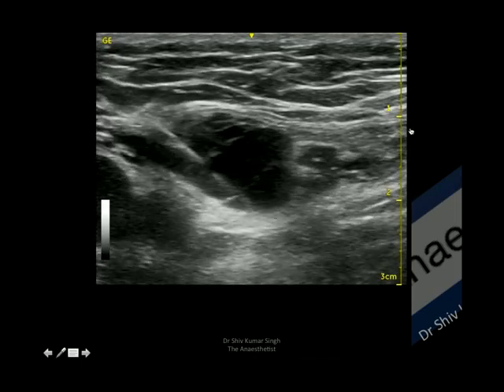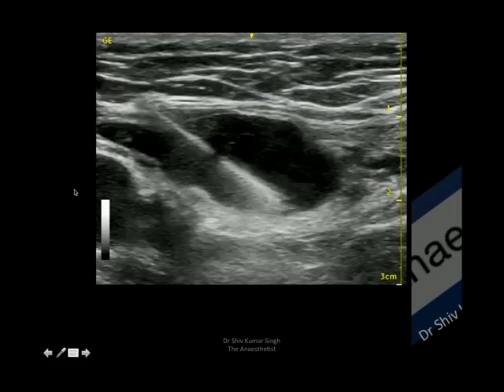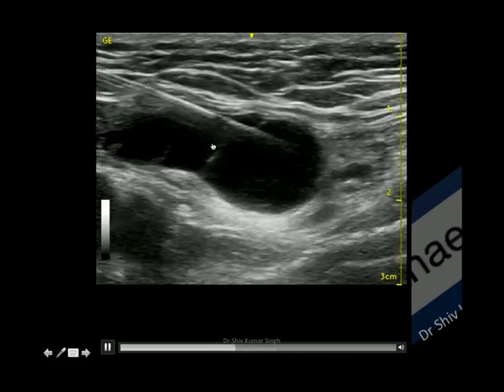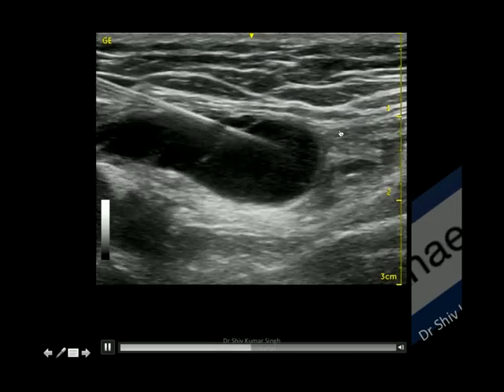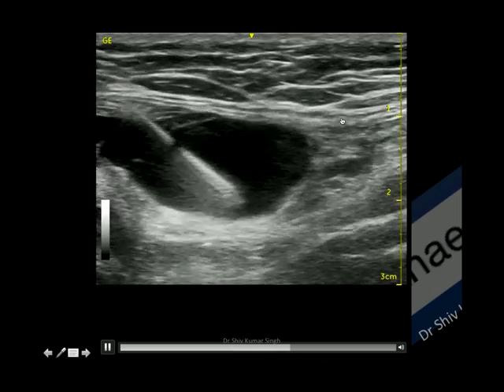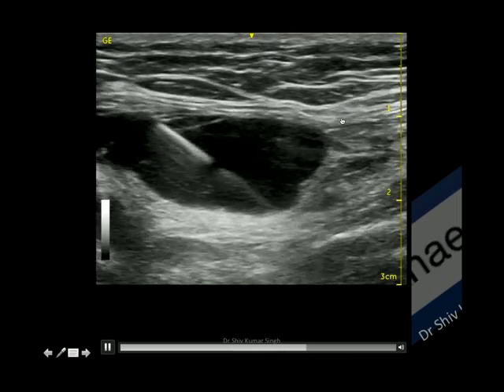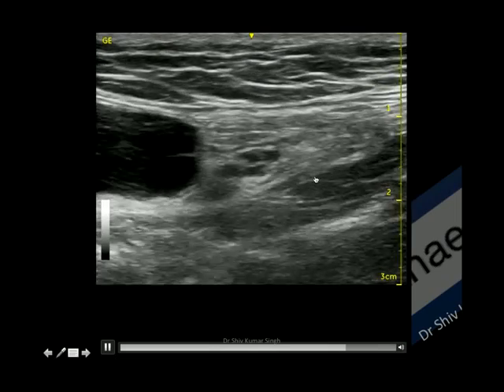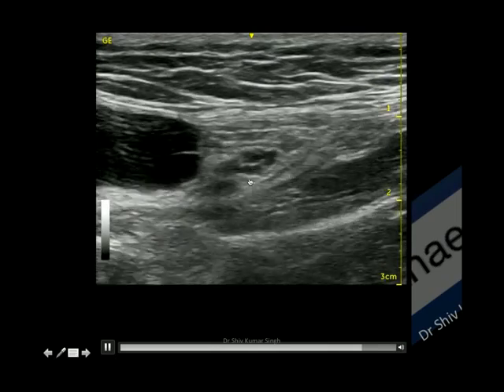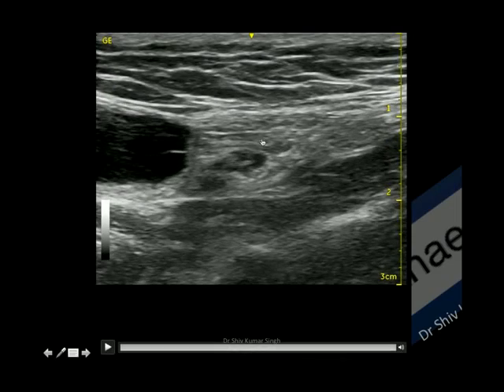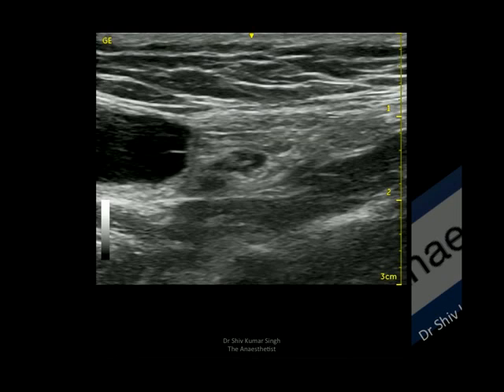This is a video of the ultrasound-guided spermatic cord block. You can see the medial and lateral sides, with the needle coming from lateral to medial. That is the spermatic cord, and the needle has gone through the fascia of the external oblique muscle, very near to the superficial inguinal ring. You can actually see the structures within the spermatic cord, and the local anesthesia will seep down to all the other branches we need to block.